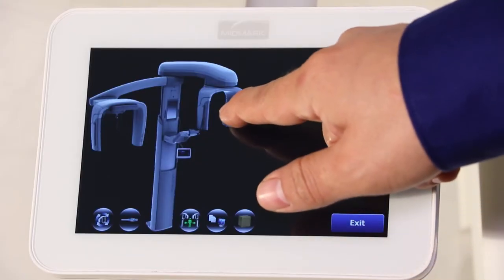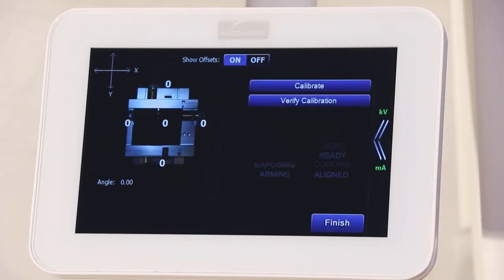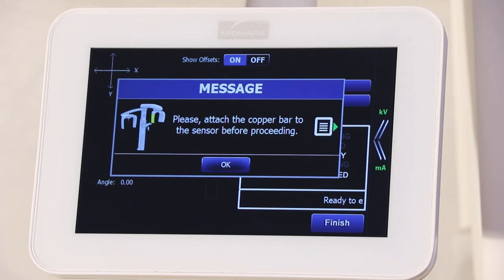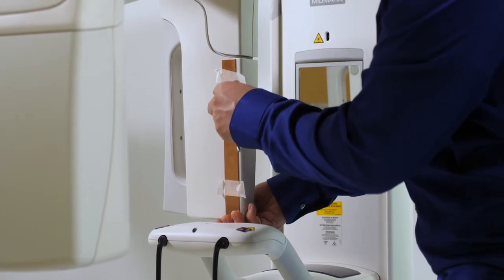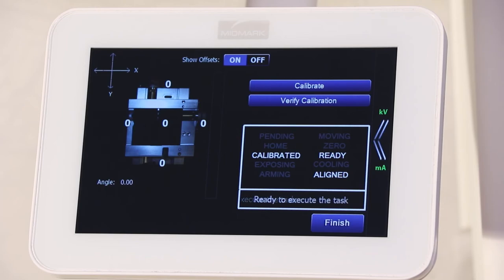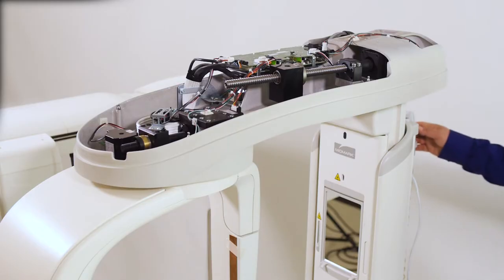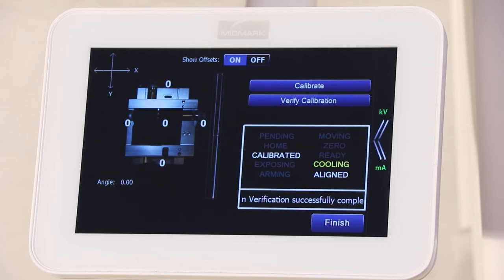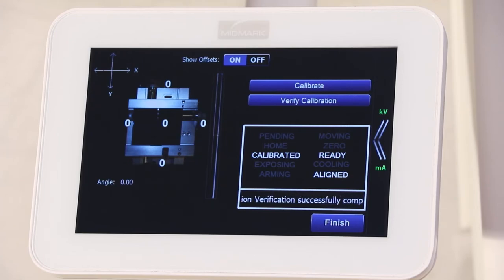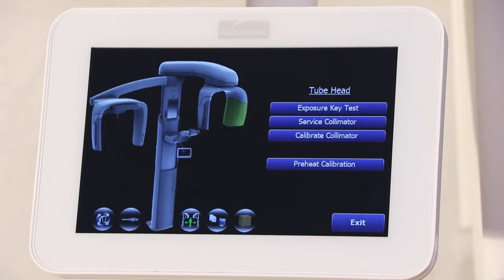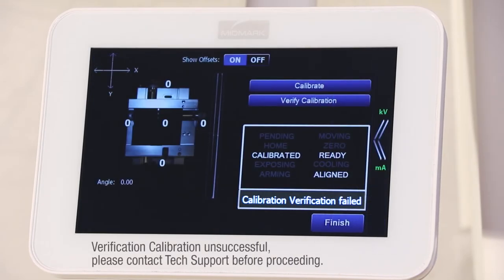You are now on the last step in the pre-check list, which is to take a pan collimator verification shot. On the service screen, select Tube Head, then select Calibrate Collimator. The message 'Please attach the copper bar to the sensor before proceeding' will appear. Attach the copper bar to the pan sensor with tape and tap OK. Next, select Verify Calibration. The unit will move into position and the moving indicator will turn red. When the unit stops moving and the moving indicator is not red, take an exposure. Once complete, the Status Text area displays the Calibration Verification Successfully Completed message. Select Finish and Finish again. Select Exit. If the status text area displays Verification Calibration unsuccessful, please contact Tech Support before proceeding.